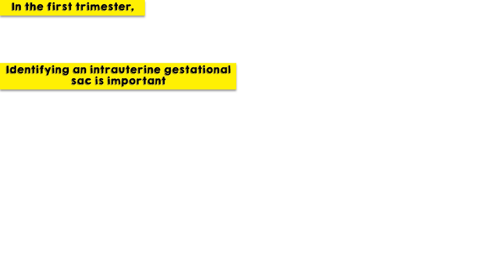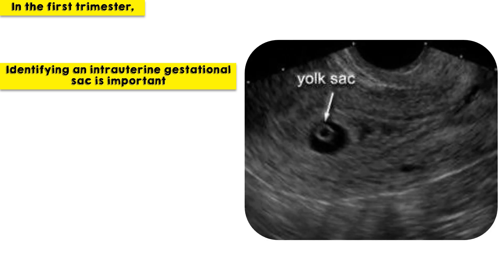In the first trimester, identifying an intrauterine gestational sac is considered a major priority. In this image, the white arrow denotes the yolk sac within the gestational sac, which confirms the intrauterine pregnancy.